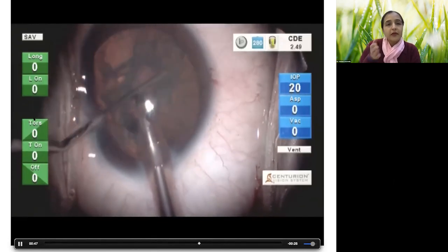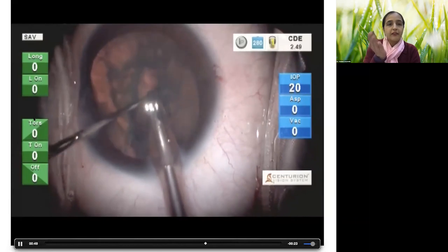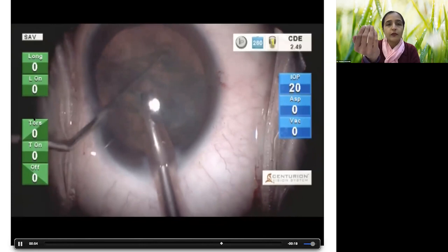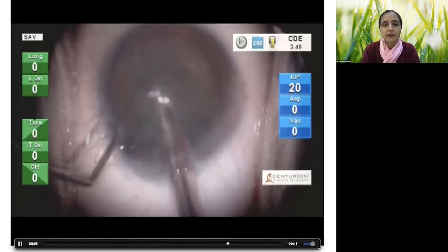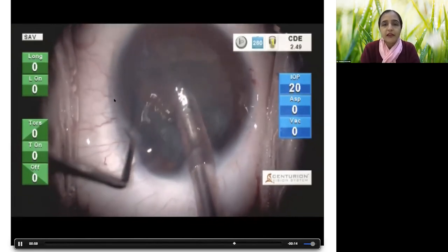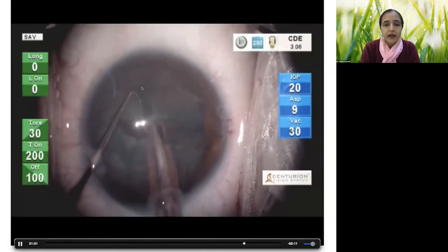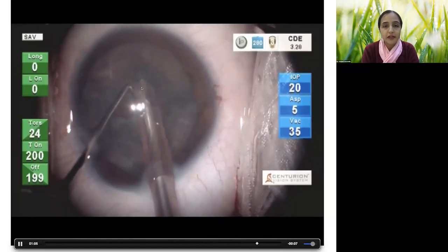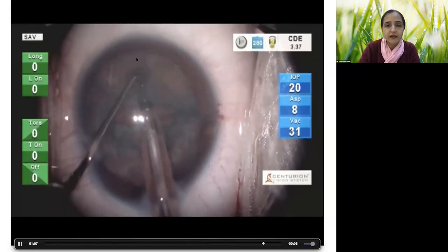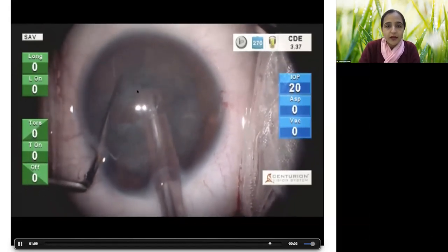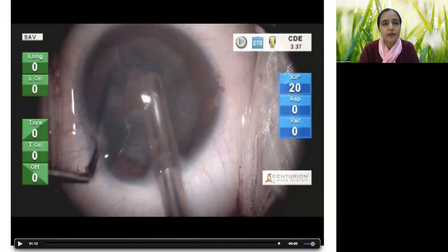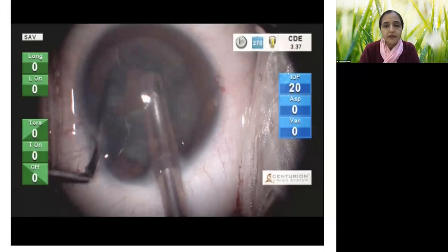When sculpting, remember the capsule is curved — not flat. If you sculpt flat rather than following that curve, you are more likely to rupture the capsule mechanically or with ultrasound energy. As you can see, the surgeon is confidently going ahead. It's a cortical cataract so the red reflex isn't perfect, especially after hydrodissection, but things appear to be going quite well, though we can't really see what's happening at the deepest level.